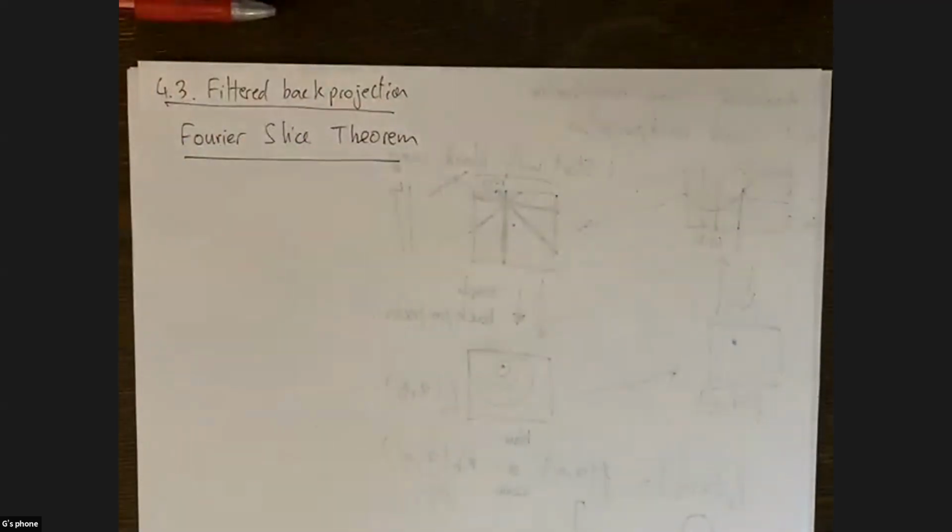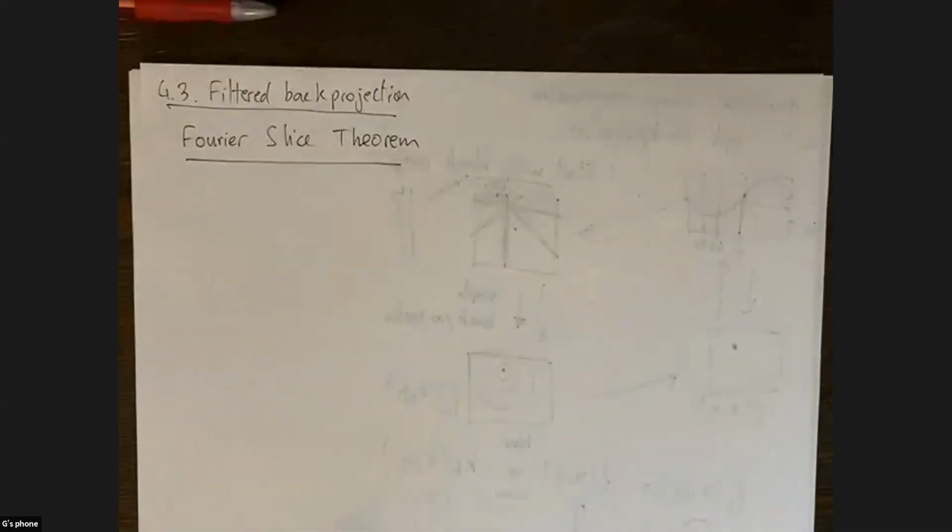Just a few words about this Fourier slice theorem. It was actually invented at Stanford, as I mentioned, in the 50s by a professor named Bracewell. Bracewell worked on microwave, radar, and things like that, and came up with this concept of the Fourier slice theorem, and then realized it was applicable to imaging. I think this was a very consequential theorem for medical imaging, because it shows that we can essentially reconstruct the images perfectly just by acquiring projections of the images. As long as we have enough projections, we can reconstruct that image perfectly.